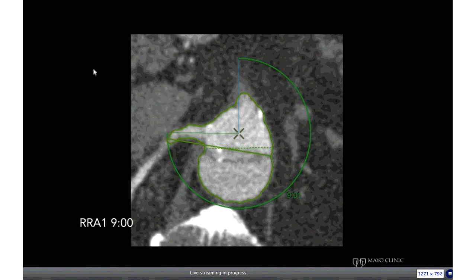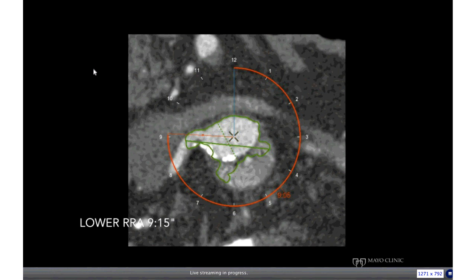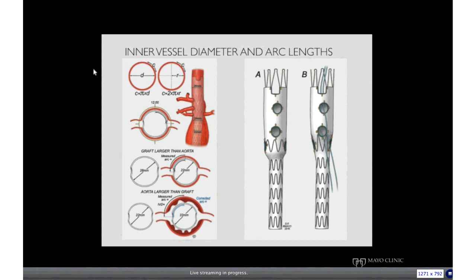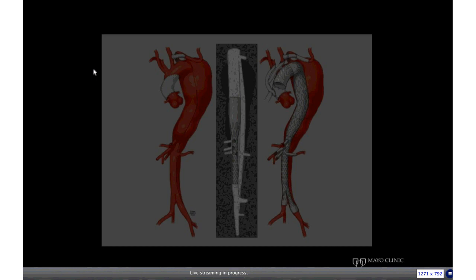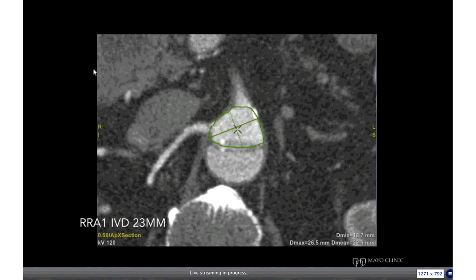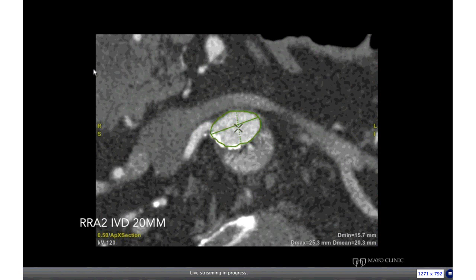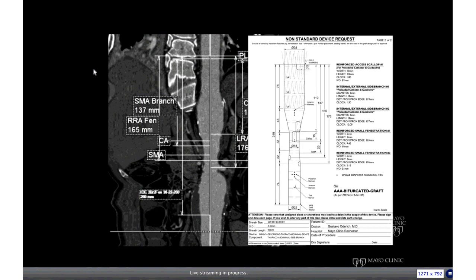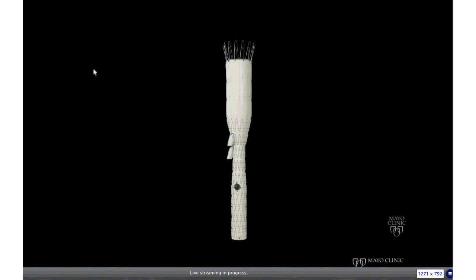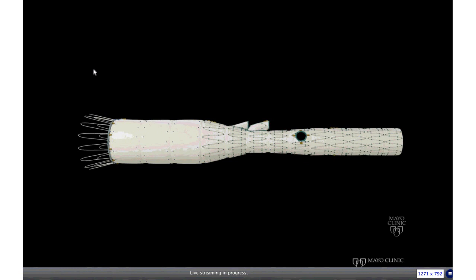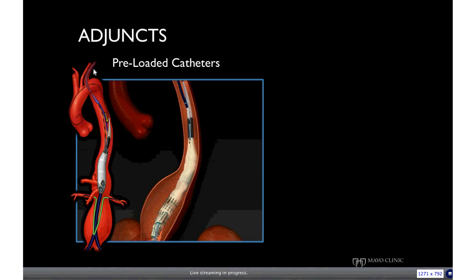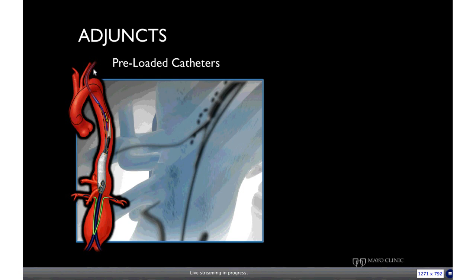This patient has a chronic dissection with true and false lumens, and we are locating the clock positions of the celiac, SMA, right renal artery, and left renal artery. This patient also had two right-sided renal arteries. Following clock position location, another important planning step is measurement of the inner vessel diameter, which is critical for the design of the main body, fenestration locations, and branches. Once all measurements are obtained, that is translated into a surgical plan and then an engineering plan. In this example, the design has two branches and two fenestrations for the right renal artery and a fenestration for the left renal artery.